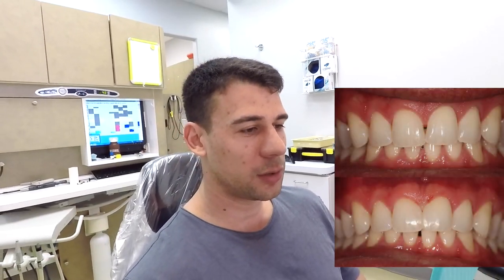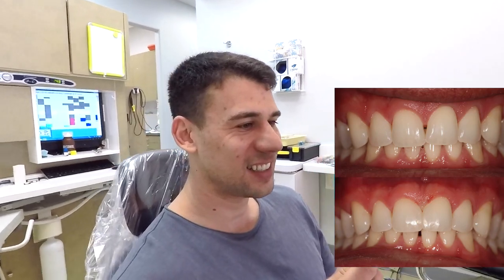Victor, what do you think of them? I think it works really well. You think the color is good? Yeah, I can't even tell.